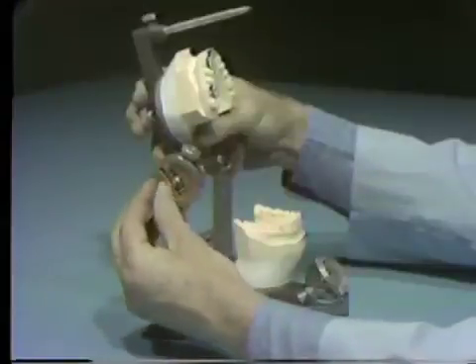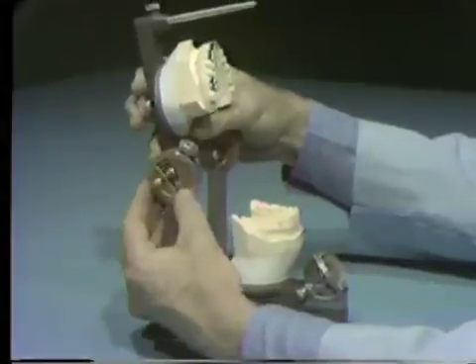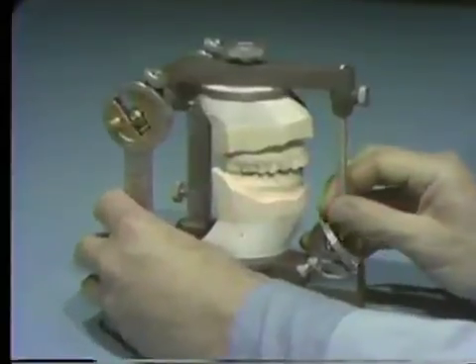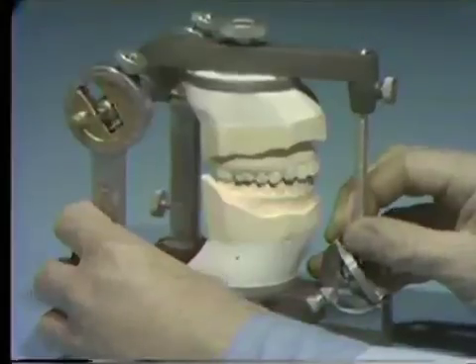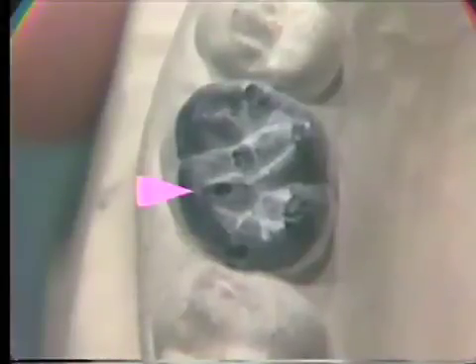Loosen the centric locks and check for interfering contacts in working, balancing, and protrusive movements. Notice the dull spot on the distal buccal cusp — this spot was made during the right working movement. The contact could interfere with smooth mandibular movements or prevent the cuspid from contacting. To prevent a working interference, the wax should be carved until this contact is eliminated.